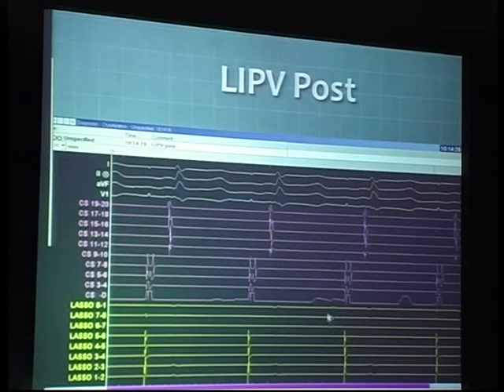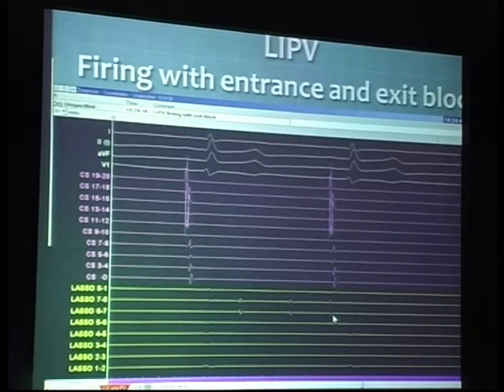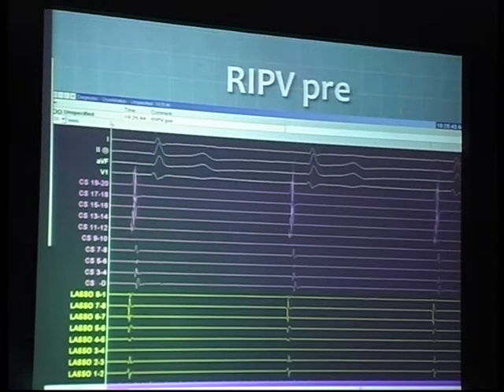There is some dissociated firing here with a little bit of ectopic activity inside the left inferior pulmonary vein post-ablation. This is a good example of LIPV post-ablation where you have pacing going on from the coronary sinus, demonstrating the entrance block. There is exit block, with none of these ectopic beats generated inside the left inferior pulmonary vein able to make it out into the left atrium — a good confirmation of an isolated left inferior pulmonary vein.